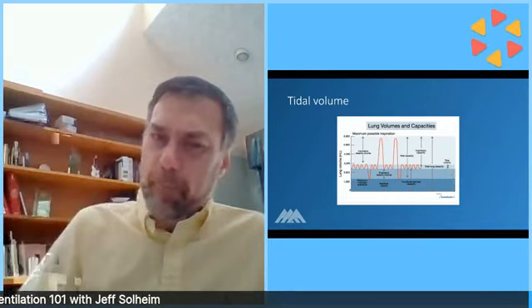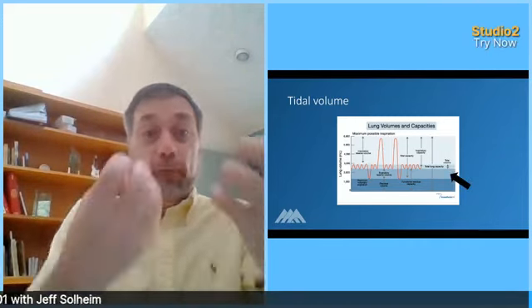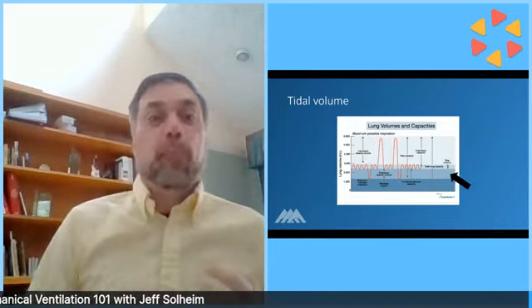Okay. Now, as you might remember from when I started this, I told you that your tidal volumes are meant to affect PaCO2s. How? Well, think about it. If I put in more air, I'm going to breathe out more air, right? So if you put in more, more is going to come out. And if more comes out, what comes out with air when you exhale? Carbon dioxide, right? So if you turn up your tidal volumes and deliver more air with each breath, your patient will exhale more and that'll bring more CO2 out. So that's why your tidal volumes are great for people who have CO2 issues. If you look at the blood gases and the CO2 is elevated, turn up their tidal volume, right?